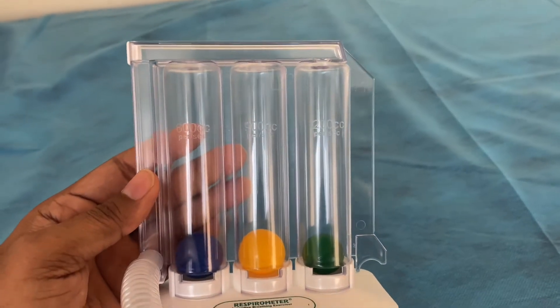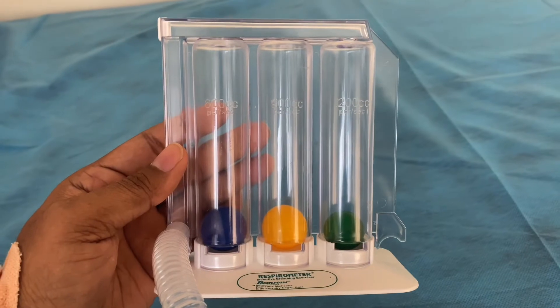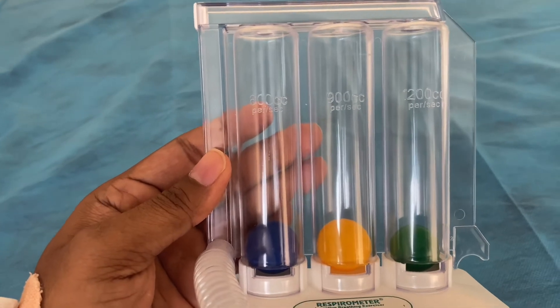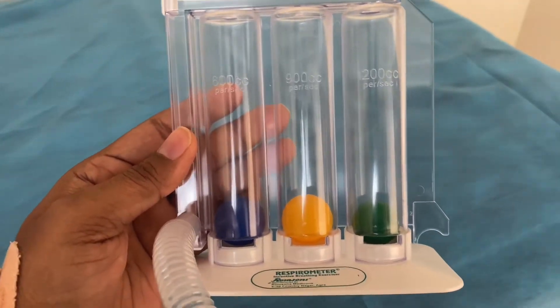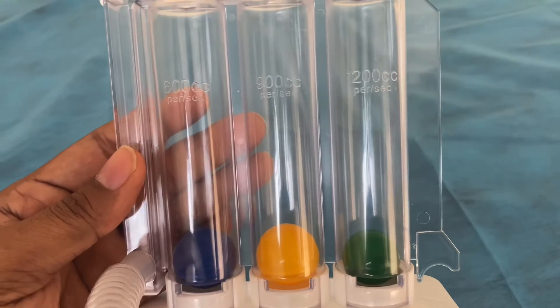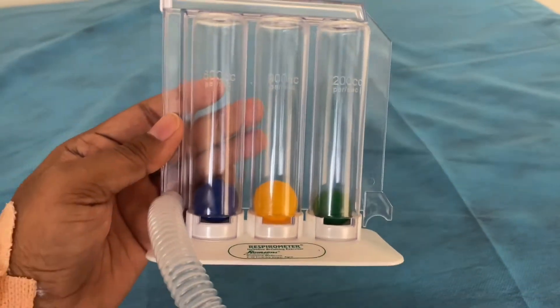The funny fact is, for me, when I started doing this, I was not able to push a single ball — not even the blue one which you can see at 600 cc. My health was so deteriorated. But now, it's God's grace, I have recovered and I can at least pass 900 cc, and I'm trying for 1200 cc. I'll show you this experiment now.